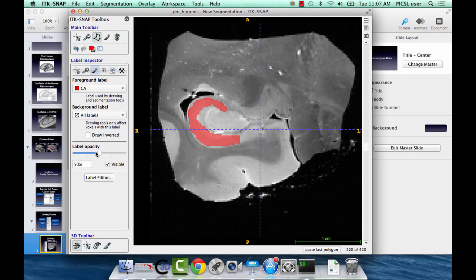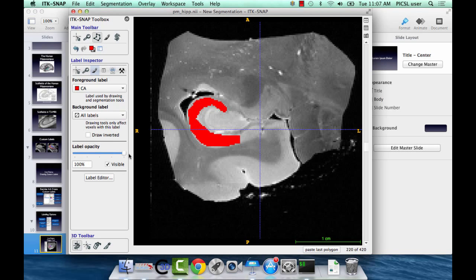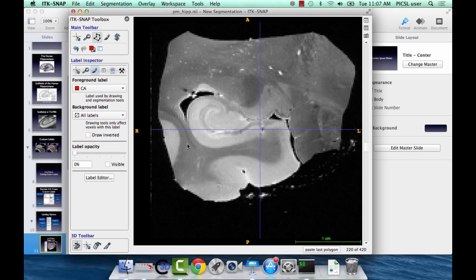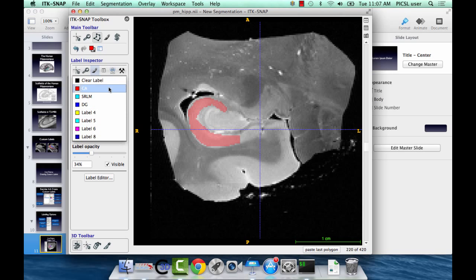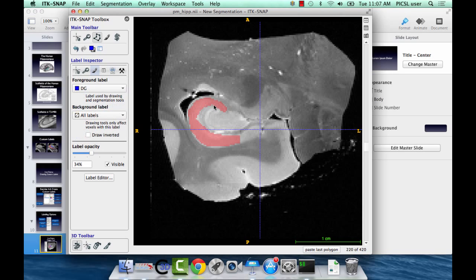Label opacity, as I mentioned, this shows you how translucent the label is. And it's useful for seeing the anatomy that's underlined there. Make sure you're drawing on the region you want to be drawing on. If it's totally opaque, you can't really see what you're doing underneath. And one really useful trick with this, there's hotkeys built in. So, S will toggle this, which comes in really handy when you're doing the drawing. And the A and D keys will toggle the opacity and translucence in either direction. So, to continue with the example, we could then draw this internal dentate structure.